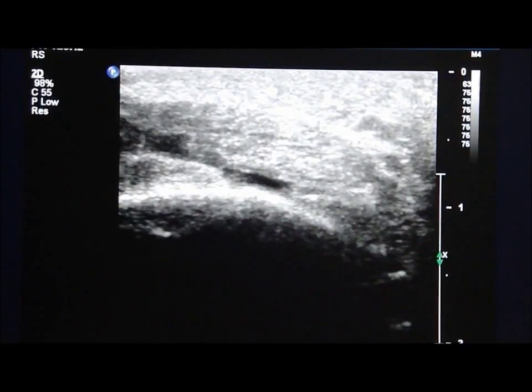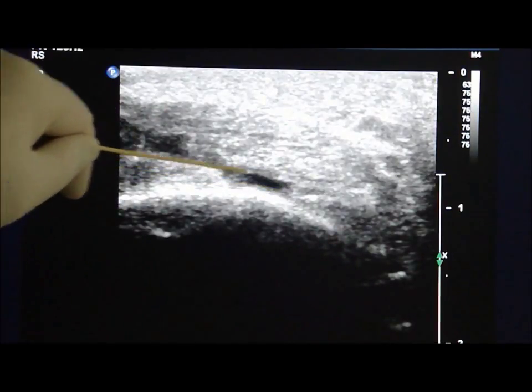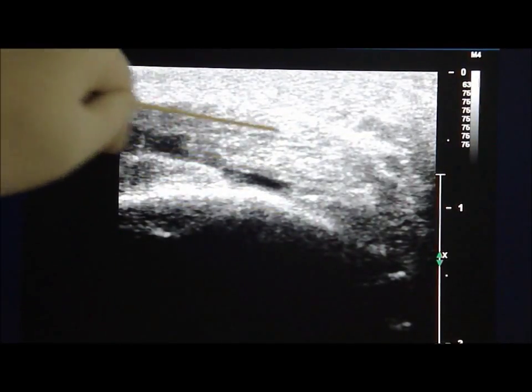The ultrasound probe is then turned 90 degrees to see the transverse view of the enlarged retrocalcaneal bursa. As you can see over here, this is the transverse sonogram showing the enlarged retrocalcaneal bursa between the calcaneum and the Achilles tendon.